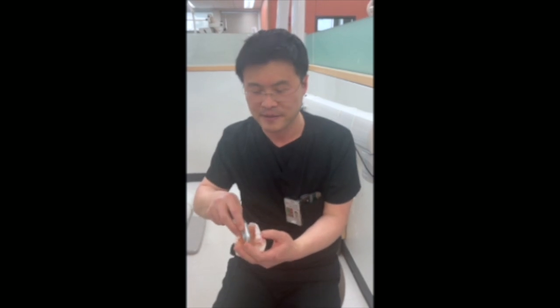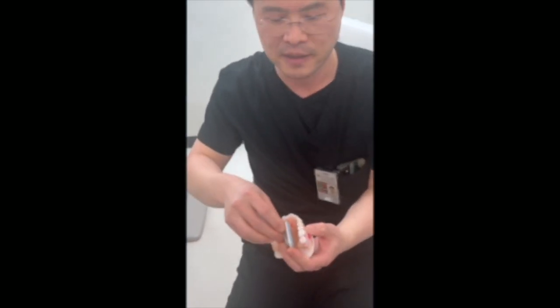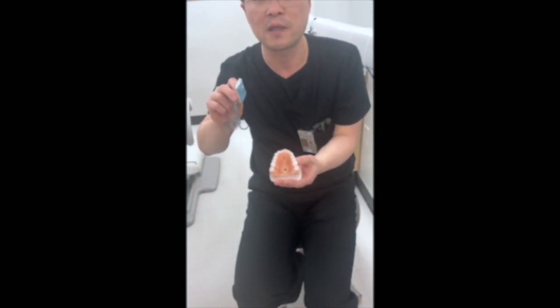Now we'll go over how to take premolar radiographs in the maxilla. Again, we want to remember that the sensor is very stiff.